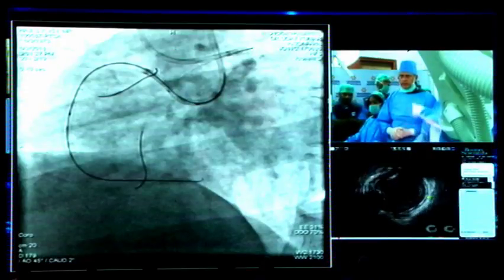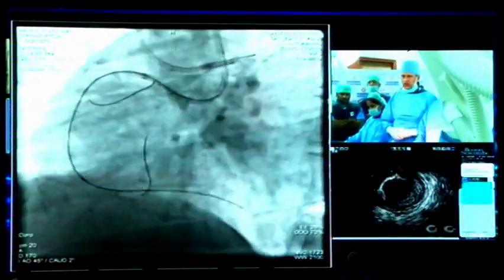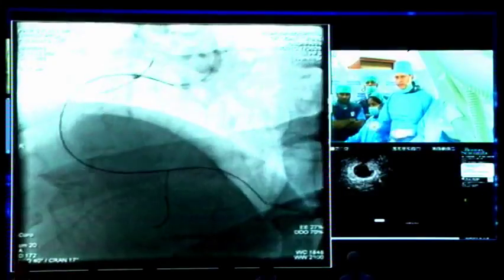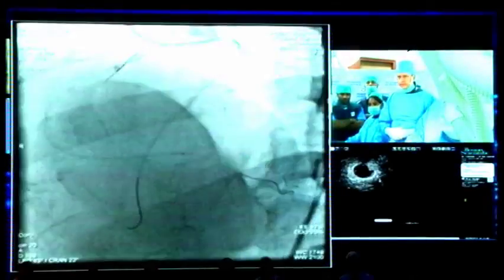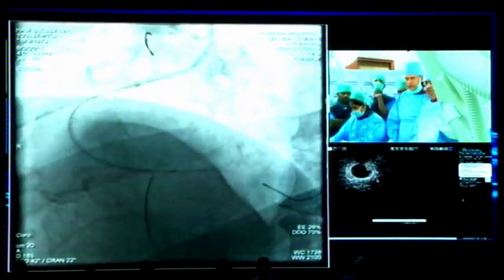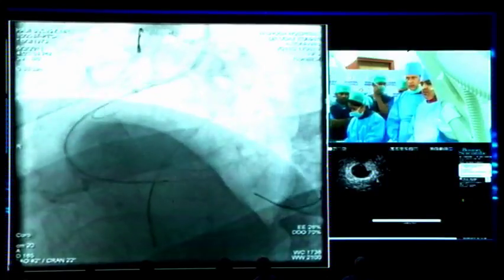Next, please, the image, the angio, please. Next. What was the size on the IVUS? It looked more than 3.5, isn't it? Yes, we decide now to put a post-stent dilatation, 3.25 or 3.5 for the proximal and 3.0 for the distal. Is the IVUS run next one? Next, please.